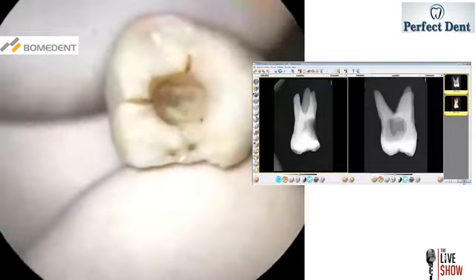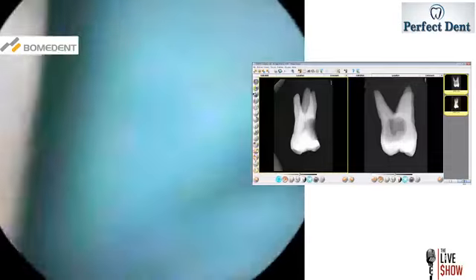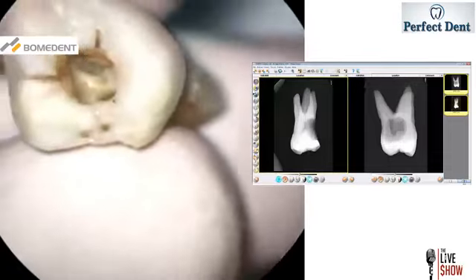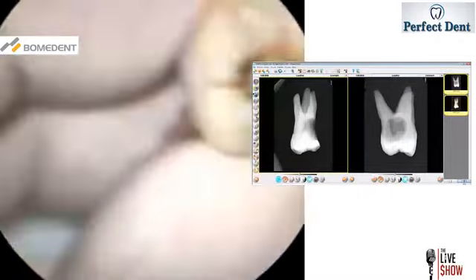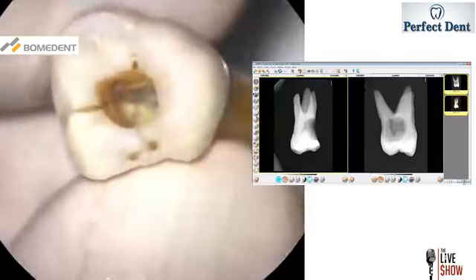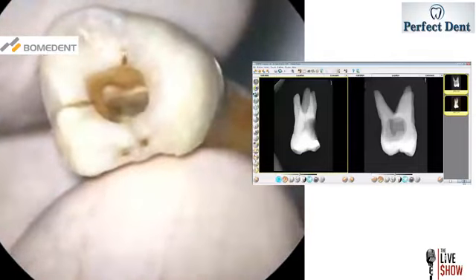Irrigation, please. Here, for instance, can I have a Pro, please?